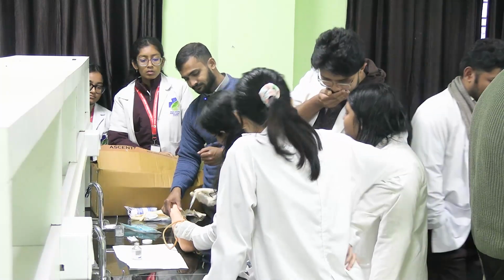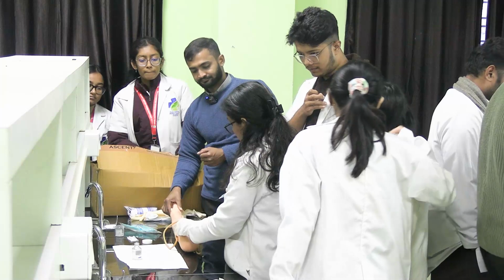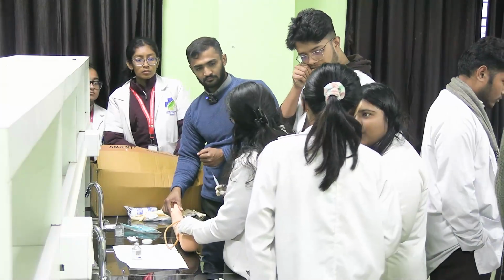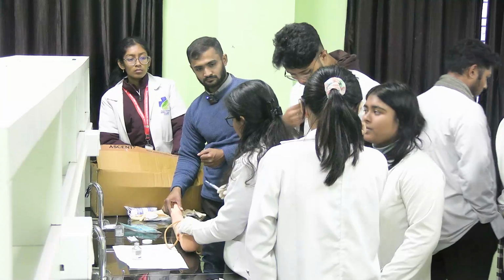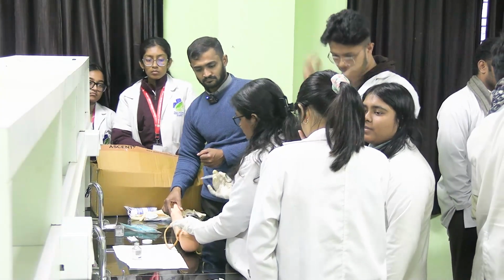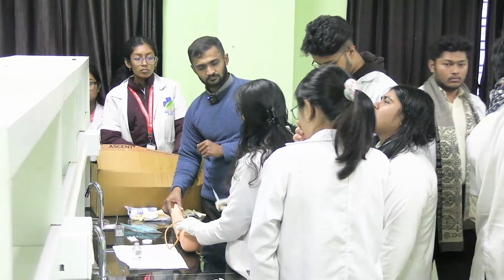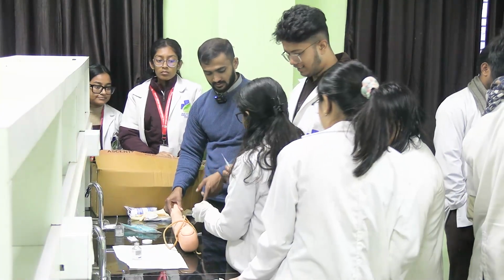What will you do then? For 1 minute I'll put the cotton swab, and for 15 minutes I'll observe the patient. Then hand wash. I will discard all these things and hand wash. Okay. Next come. Cover it.